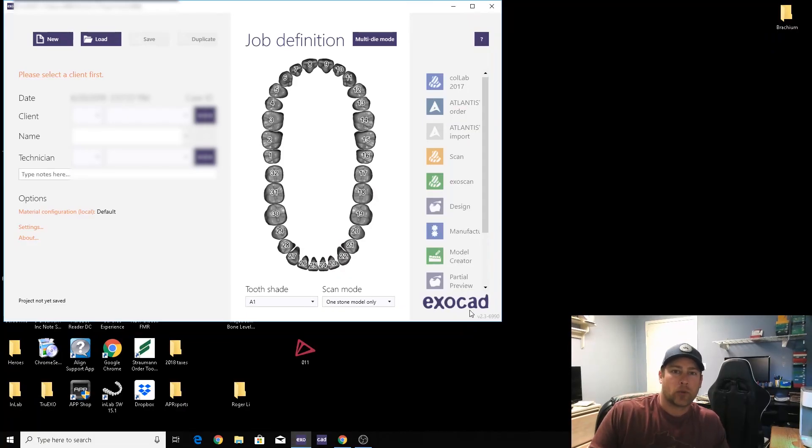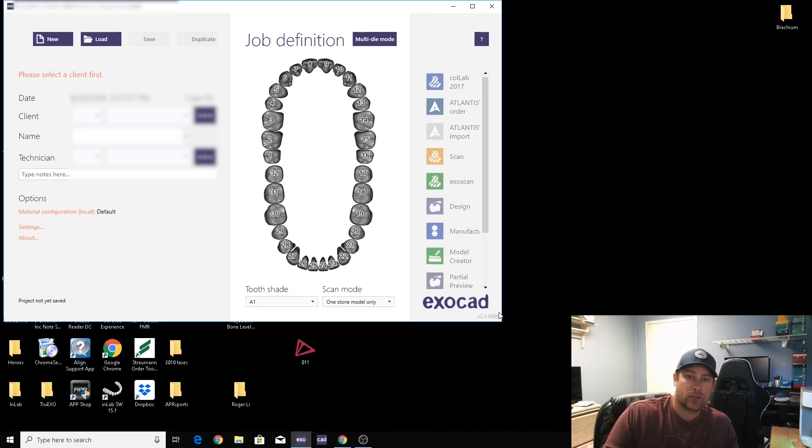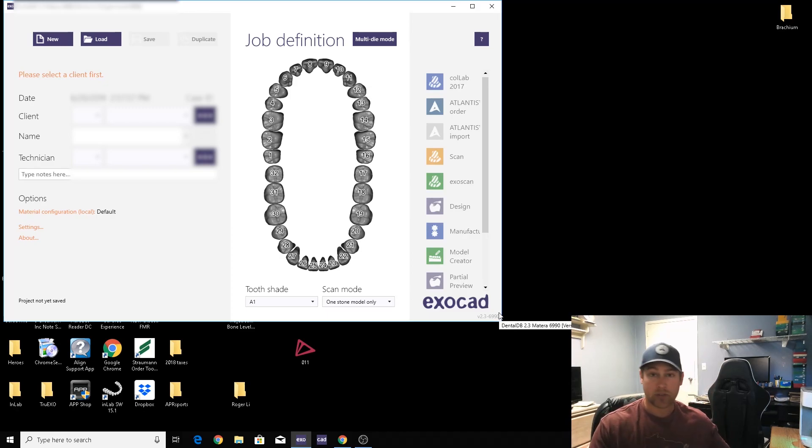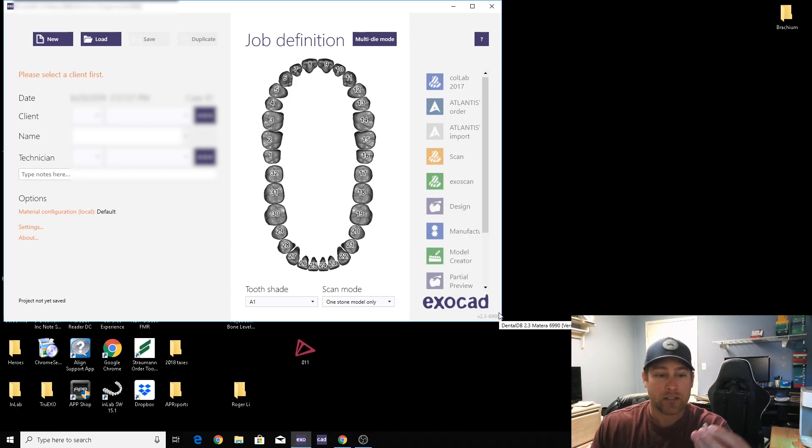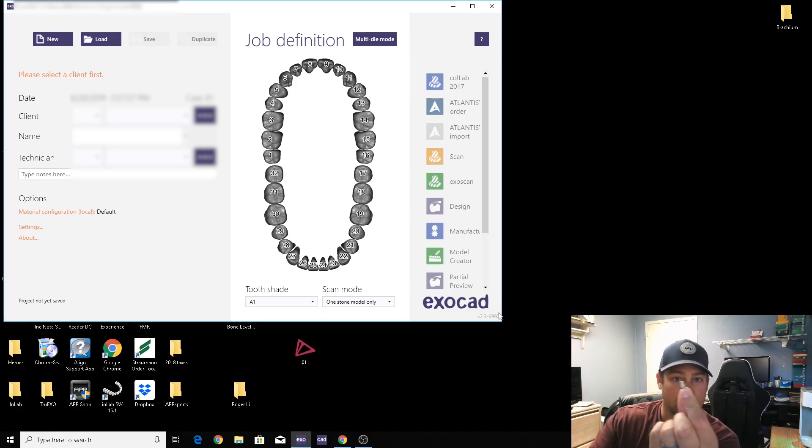Welcome back. For today's video, we are going to be scanning a screw-retained zirconia crown using a scan body. For those of you that don't know what a scan body is, this is what it looks like right here.